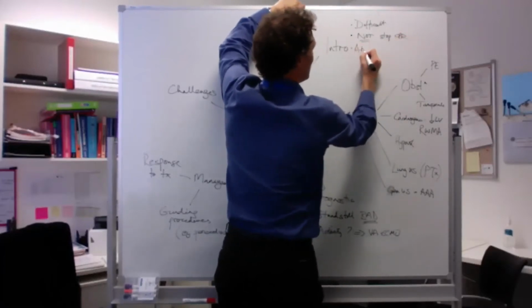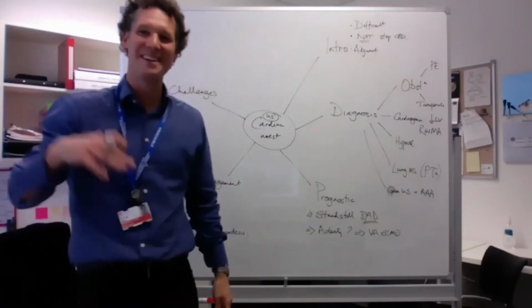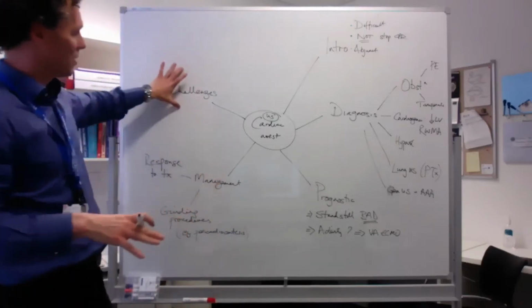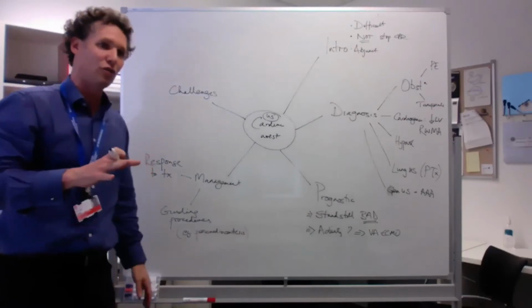And echo is an adjunct to help you with diagnosis, prognosis, and management. So some of the challenges. Discuss your use of it. Absolutely, it's in here. But how the hell do you do it?